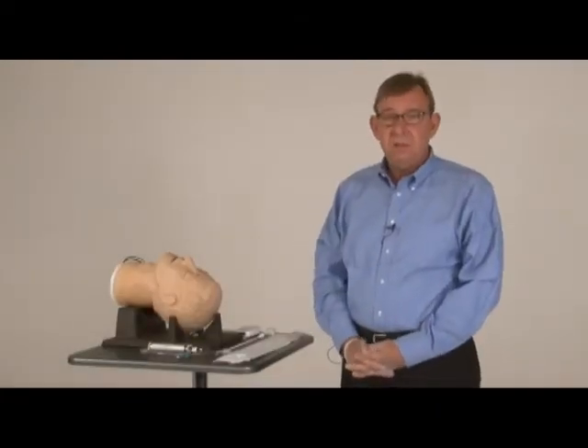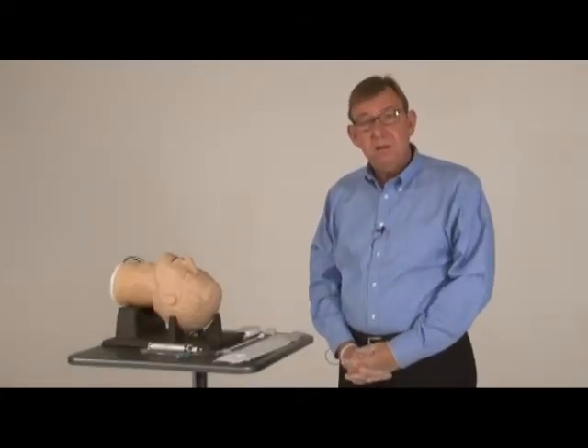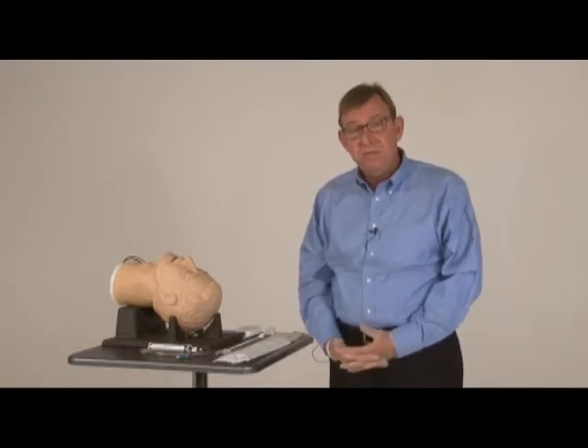My name is Dan White. I'm a paramedic and I write the EMS Technology column, Insights on Innovation, for ParamedicTV.com and EMS1.com. Today I'd like to introduce you to the ViewStick.